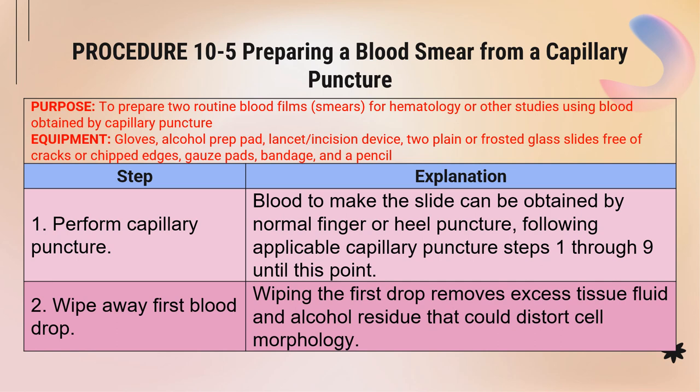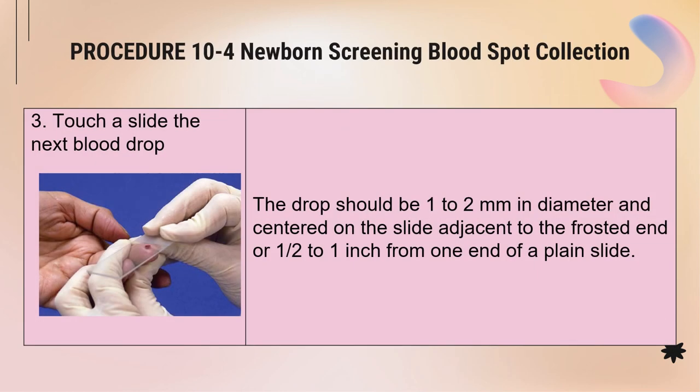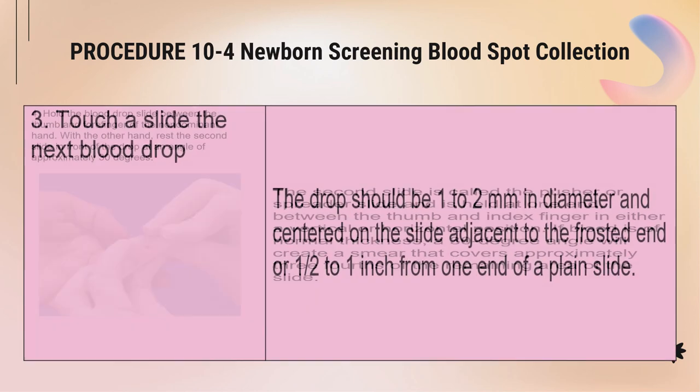So first, perform the capillary puncture. Second, wipe away again the first blood drop. Then third, you touch the slide to the next blood drop. Okay, so based on the picture, you should notice that the phlebotomist touched the blood drop 1/2 to 1 inch from one end of a plain slide, so not in the middle. You should put it 1/2 to 1 inch from the end of the plain slide, near the end or adjacent to the frosted end. Okay.